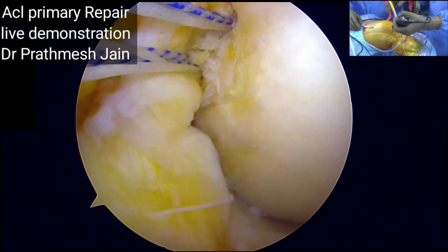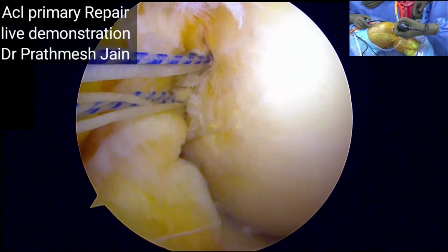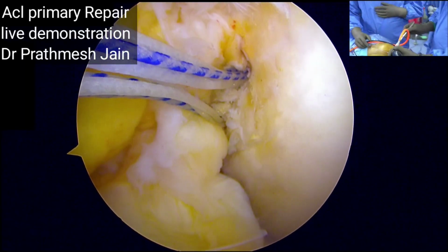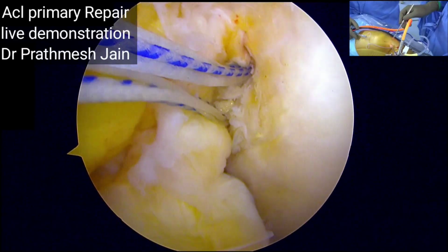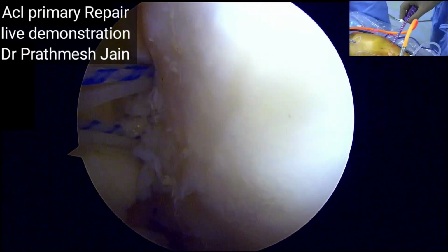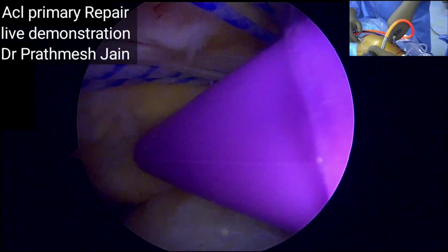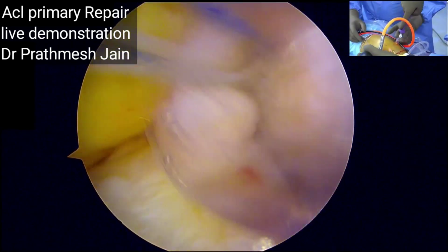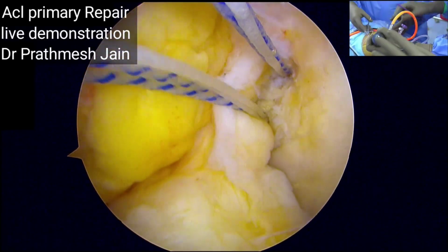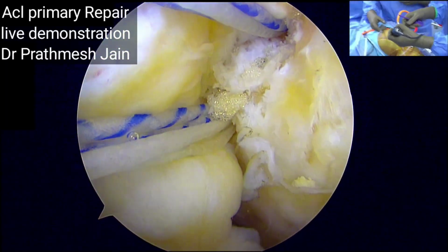Probe please, and cannula please. And now, knife please. Now I would make my lateral portal a little bigger, so I'll just increase the dimensions of my lateral portal like this. And then I would be using a 7 mm cannula to actually pass my sutures or hold my sutures. Can you hold, come here and hold this like here, okay?